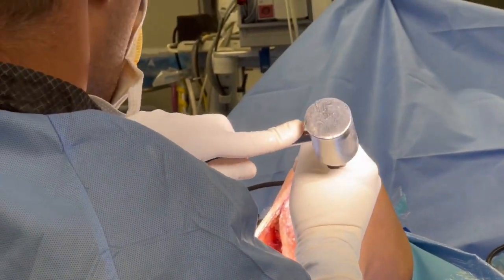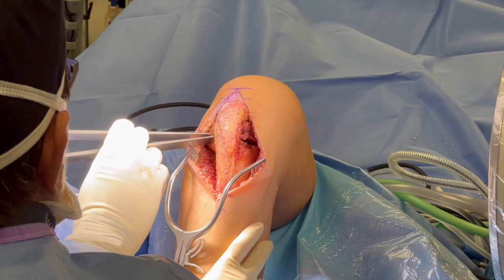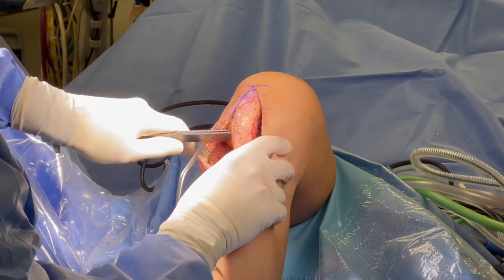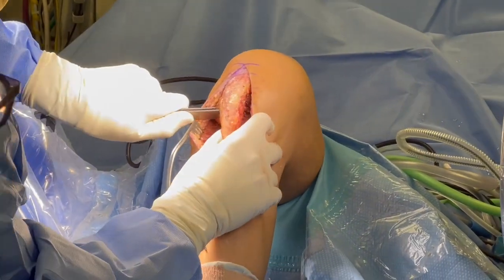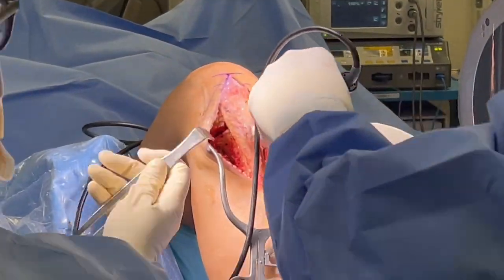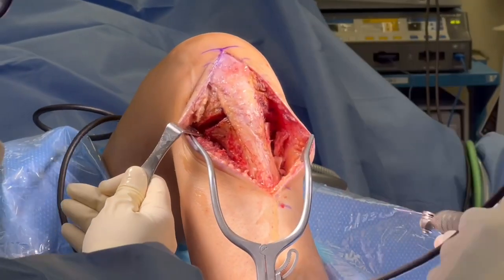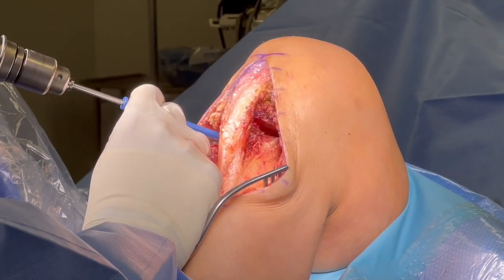We're going to use sequential osteotomes, always checking on fluoroscopy as we go towards the back of the knee. Sometimes you can use a wedge technique or a laminar spreader, and you can see here we're trying to pull off and pull out the piece that we removed. You can see the piece is removed and now we're starting to get some gapping.